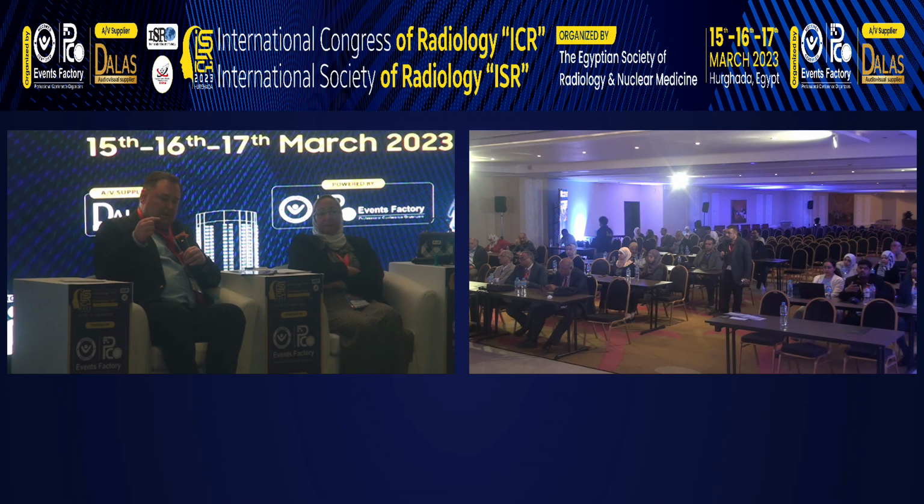In the liver diagnostics, the properties of the particles are a bit different. They are specially designed to be filtered out mostly by the first, second pass through the liver and through the spleen, because you need to have a very high uptake of iron in the liver.